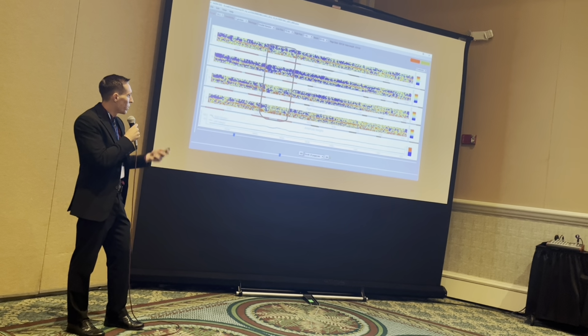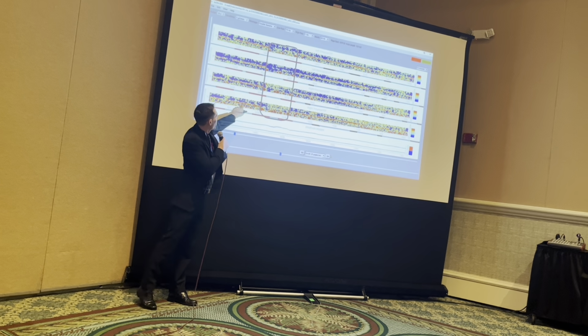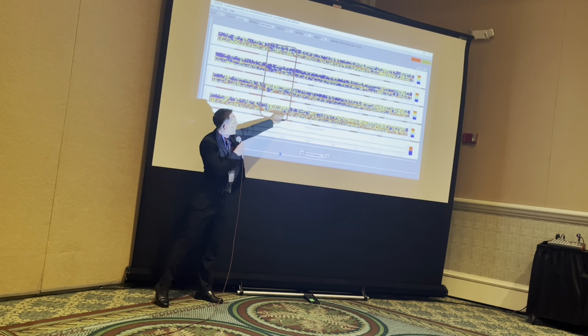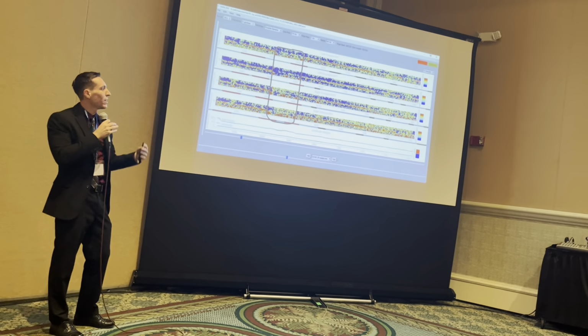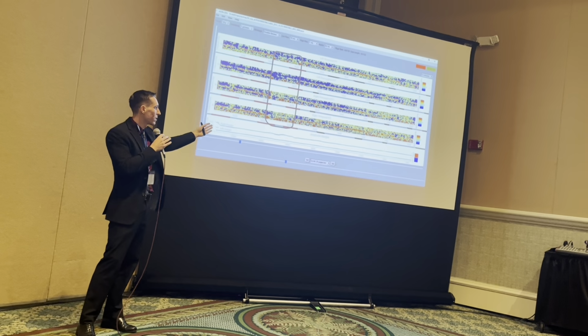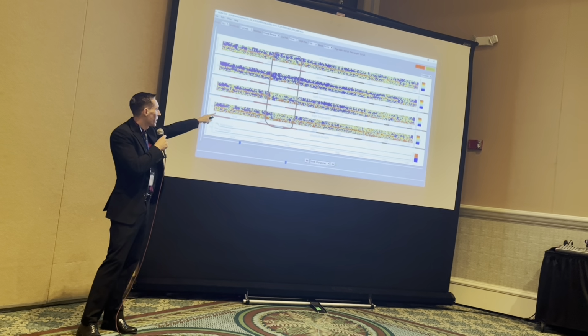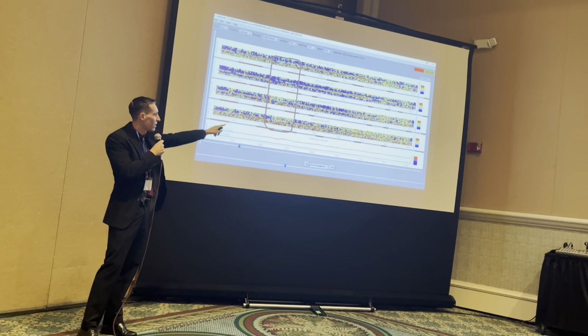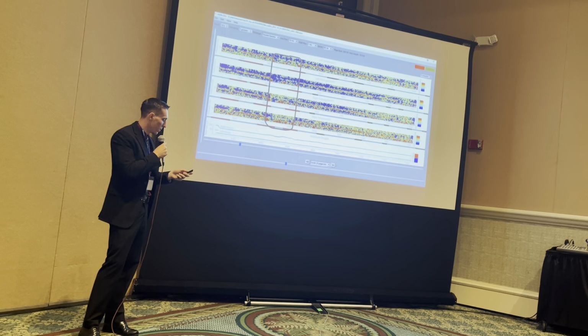And when the patient opens their eyes over here, the red stripe disappears, because that's representing the background attenuating with the patient's eyes opening. So you have the background when the patient's eyes are closed and relaxed, and it disappears and is reactive when the patient's eyes open.